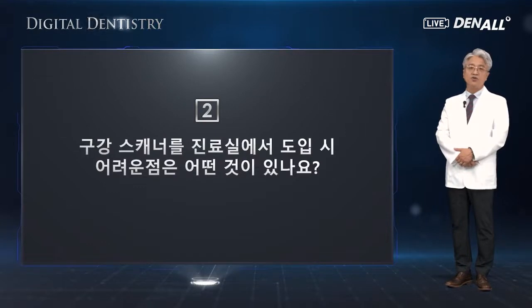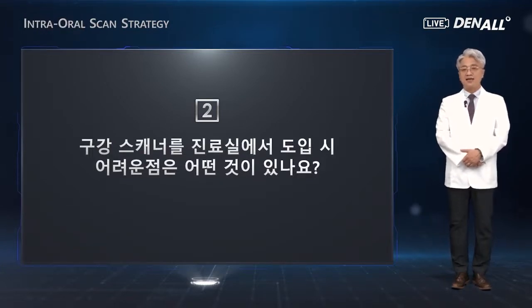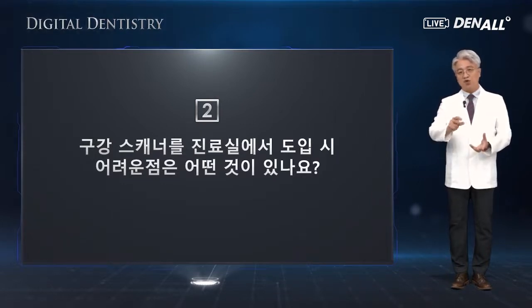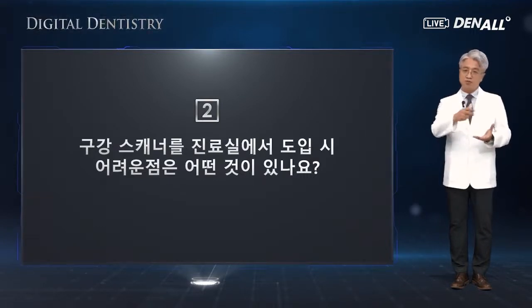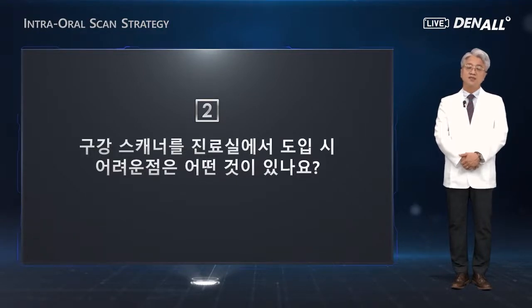The next question, in adopting the oral scanner in the clinic, what are the barriers? When the intraoral scanner is adopted in a clinic, the most difficult part would be the learning curve for people to get used to it. Dentists and staff, both professionals need to understand the new technology and apply it clinically. So some effort needs to be exerted by both parties to get used to it.